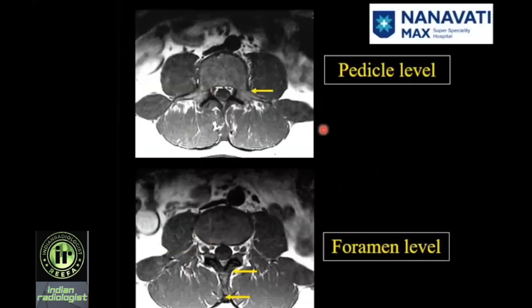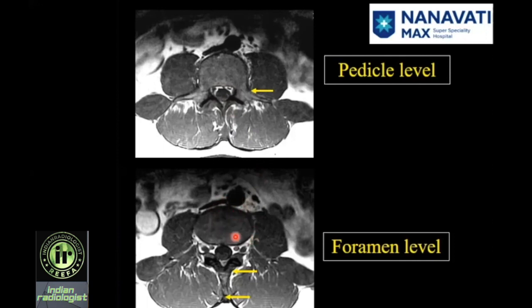At the pedicular level, you have the vertebral body — this is L4 vertebra again — pedicle, transverse process, mammillary process. This is part of the superior articular facet of L4 and part of the inferior articular facet of L3. This is the spinous process. This is the thecal sac, and these are the traversing neurons — at L4 vertebral level, these are L5 neurons. At the foraminal level at L4-5, we have the thecal sac, spinous process, lamina, dorsal neural ganglion, and the veins communicating the paravertebral venous plexus of Batson and the epidural veins.